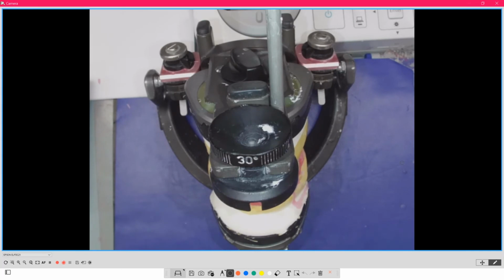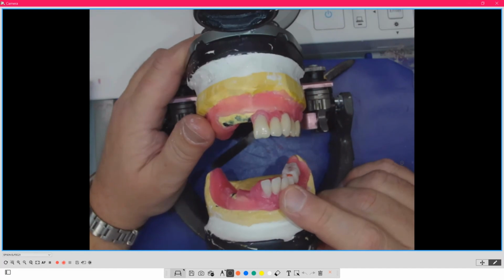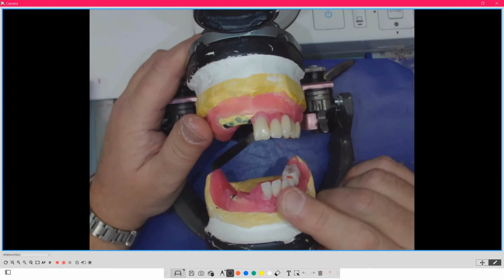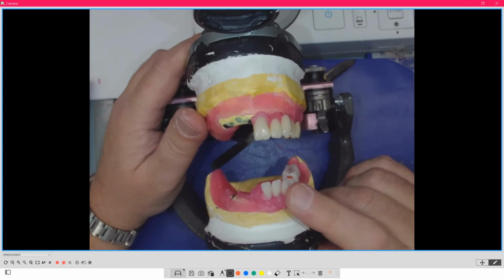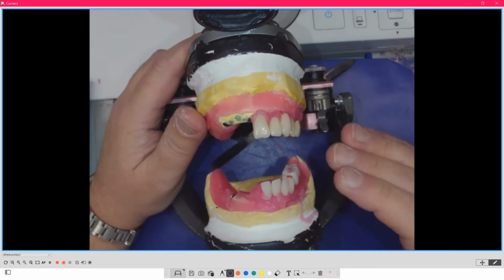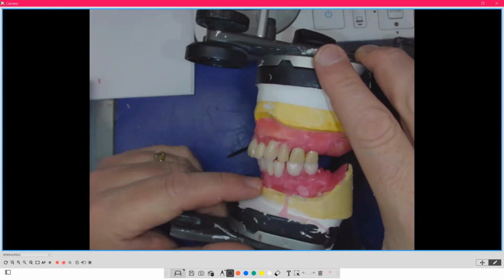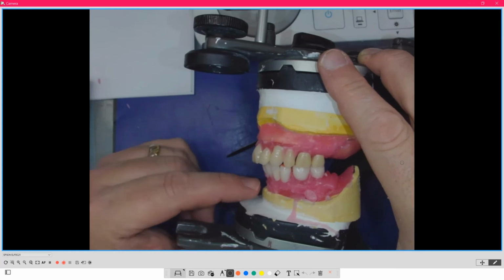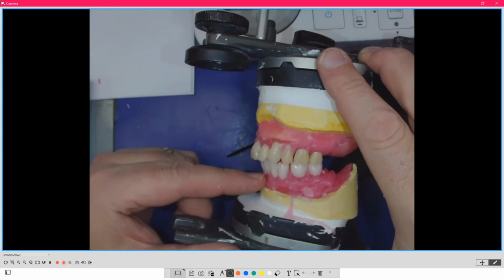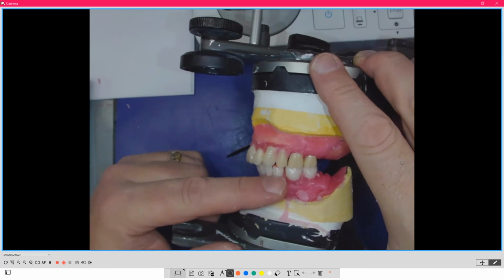So if you can set a full complement of lower anterior teeth in there and not have to do this, that's fine. What I like about the VITA teeth is that they're designed and have the principles designed that I can modify them and change them, and you don't see it. And they allow themselves to be manipulated and worked. So I've got the necks tucked in so that I'm not exceeding the zone limit here of the sulcus, because I know that orbicularis oris muscle, that lower lip muscle, is going to be really tight in here on a class 2, and I have that flexibility in here.